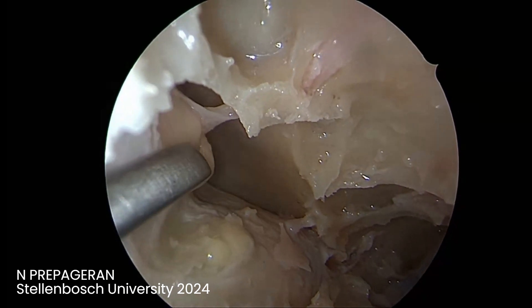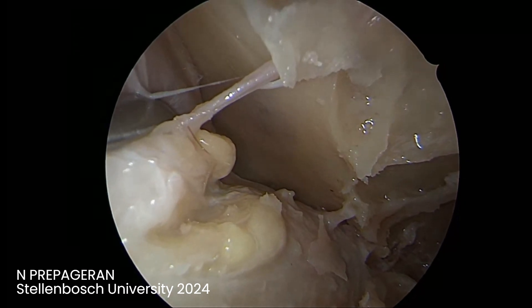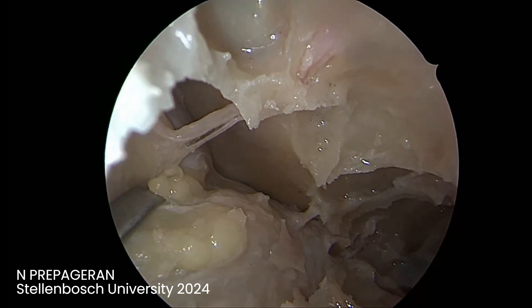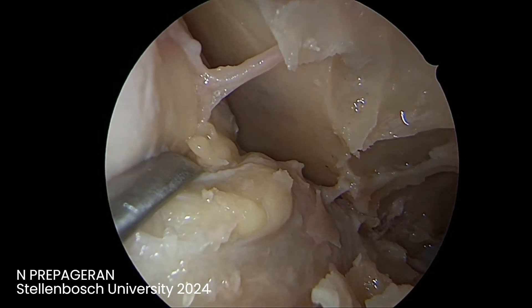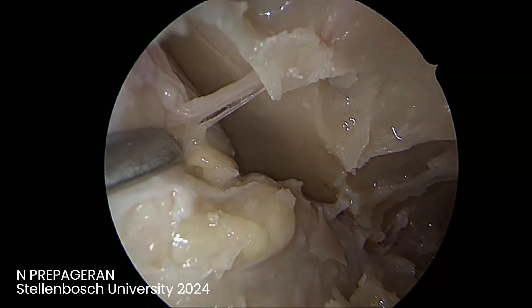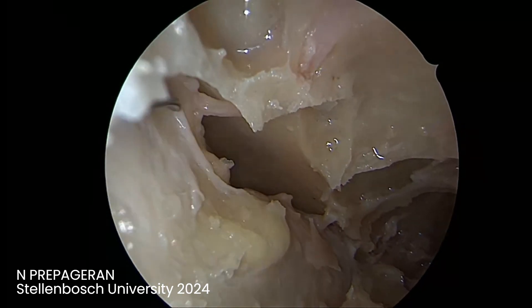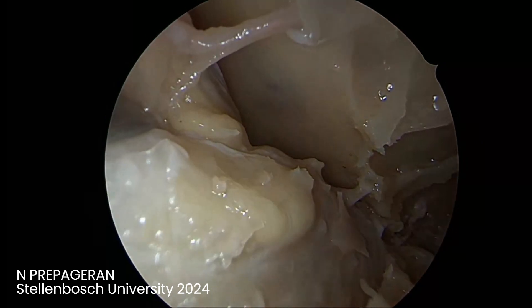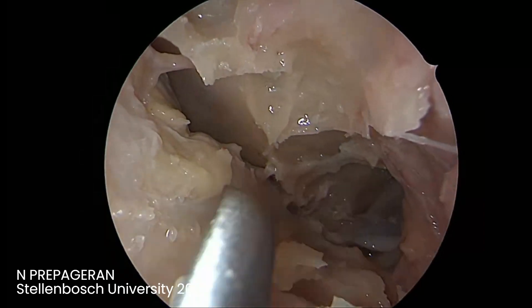This is the plane between the superior oblique up there and the medial rectus down here. This is how you enter the intraconal orbit. Can you see the superior border of the medial rectus muscle and the inferior border of the superior oblique? This is the junction between the superior oblique and the medial rectus and how the artery goes in between. This is your entrance to the cone of orbit if required.